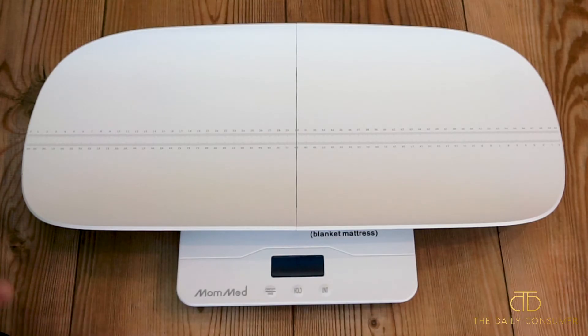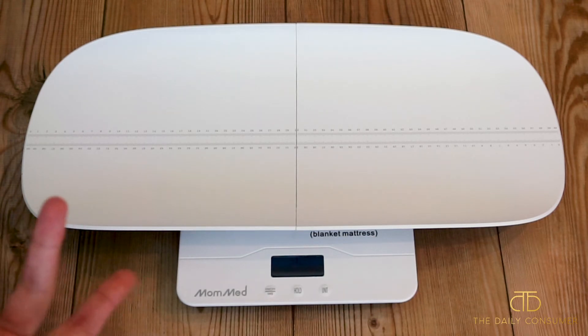It has a sticker on the bottom main scale portion that says you want to make sure it's on a hard surface, just to make sure you're getting an accurate measurement. I didn't take that sticker off, but obviously you can do so if you want.